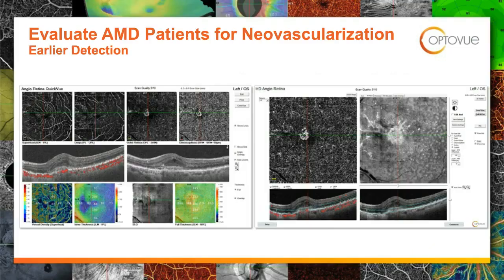As we're seeing if any other questions roll in, I went back to this slide 21 here for this patient or this doc or the colleague out there that was asking about active or passive. If you look at this left-hand scan here, if you look at the top row, there's 4 images. You're looking at the superficial retina. There's no, and the deep, which is the second one over, there's no choroidal neovascular membrane. You're looking at the third over, which is retina, and then the choriocapillaris, which is the fourth. You can see the membrane.